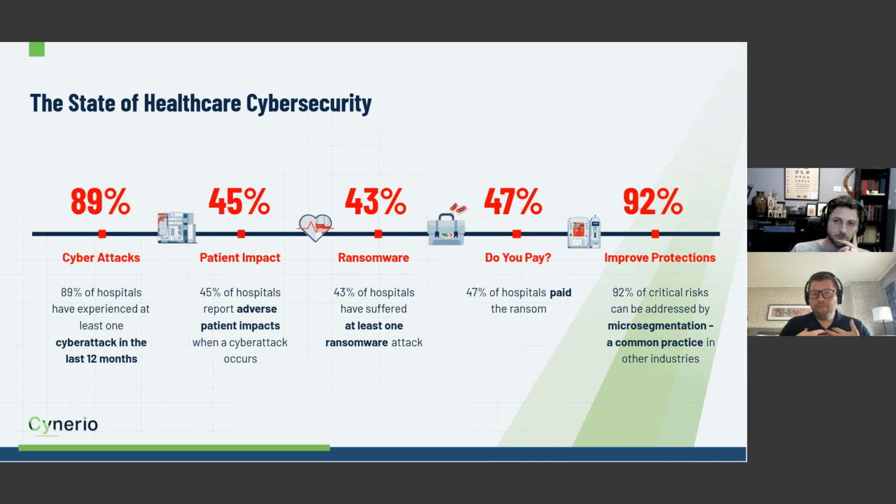One that our team focuses on in particular is something called network segmentation or microsegmentation, effectively minimizing the communication between devices. So only a device that needs to talk to another one can talk. There is no unnecessary cross chatter. And what happens when you do that, it stops the spread of attacks. So maybe one device or two devices get taken out, not hundreds or thousands.